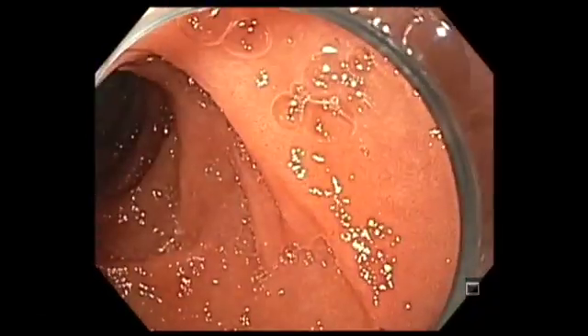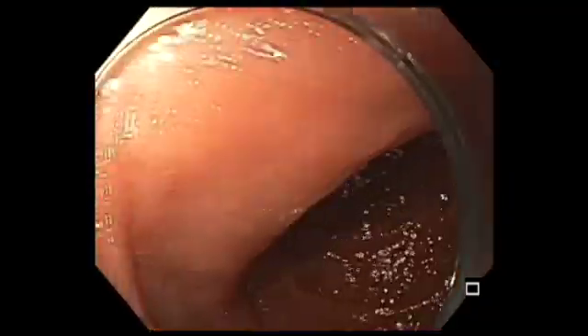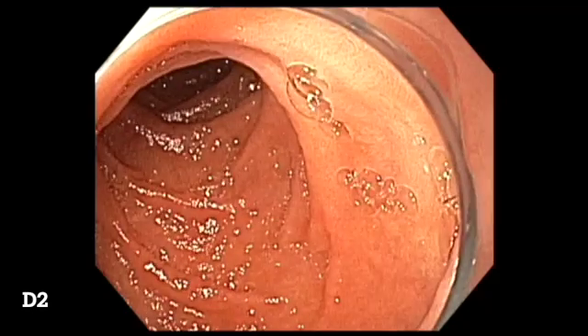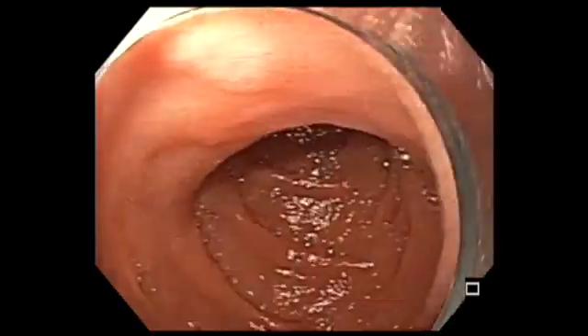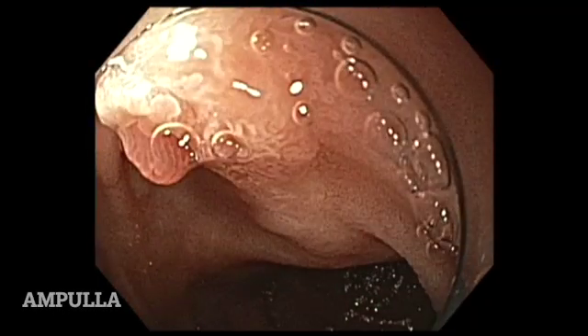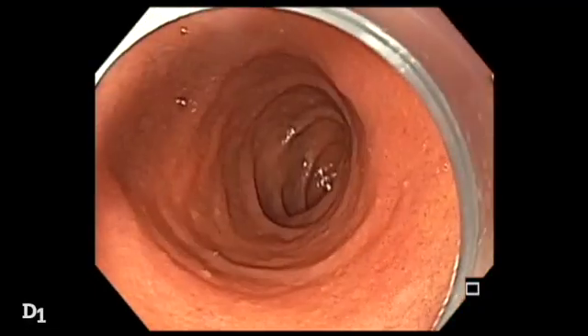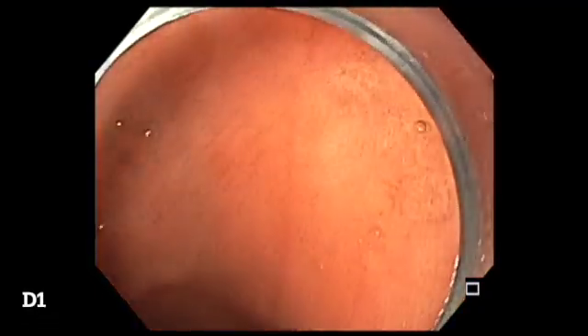As you are coming out of the third portion of the duodenum, it is a good idea to examine circumferentially, and also focus on trying to see the ampulla. The reason I want to see the ampulla is to make sure that we don't miss any ampulla adenomas.